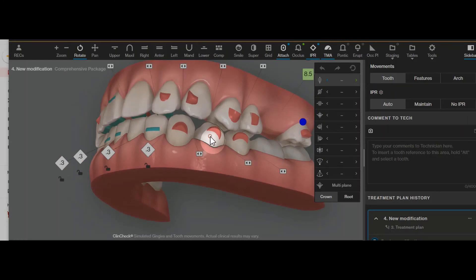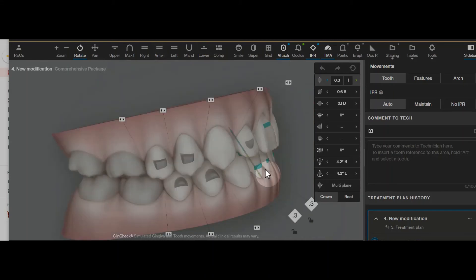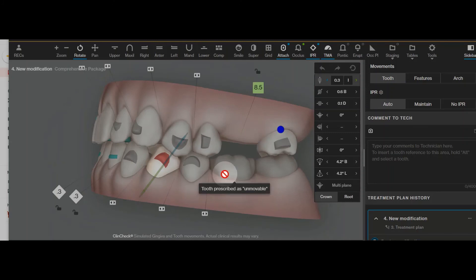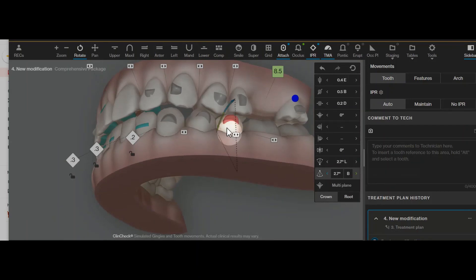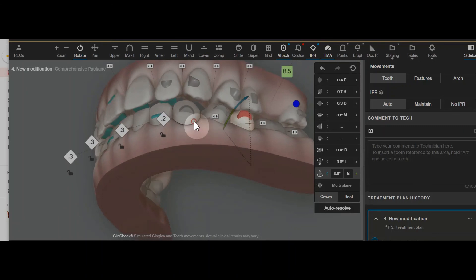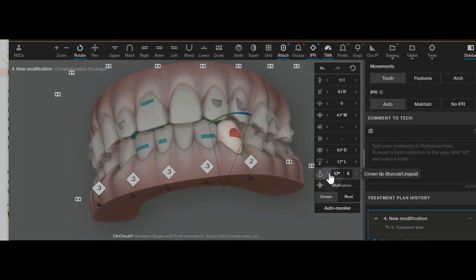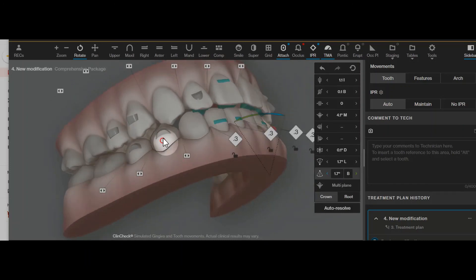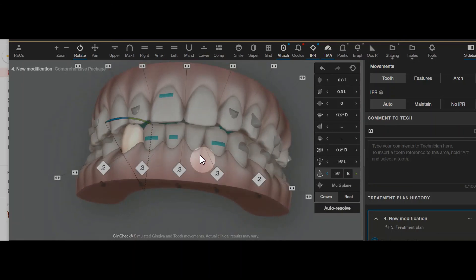One thing I noticed is that some of these premolar relationships could be improved. They're not going to be perfect with perfect canine guidance because this patient has a slightly Class 3 tendency on the left side. But we could increase some of the buccal inclinations to create better cusp-to-fossa relationships. When we do that, I have more of an opportunity to do some tip expansion by tipping of the canines, and that can allow for the IPR to then be reduced.